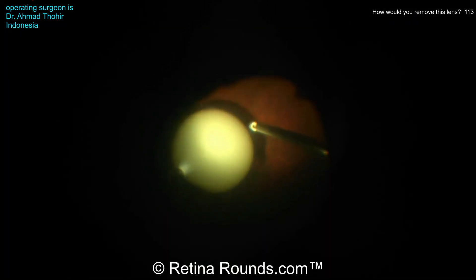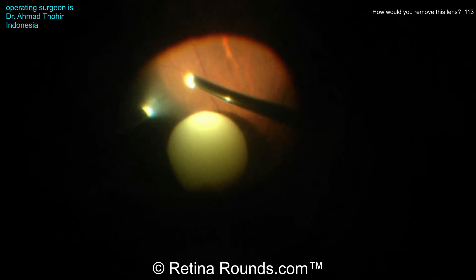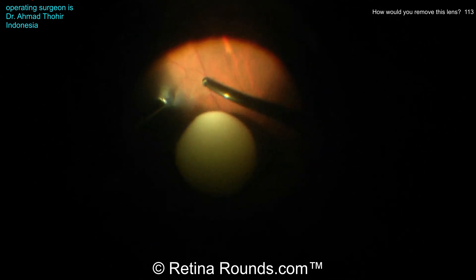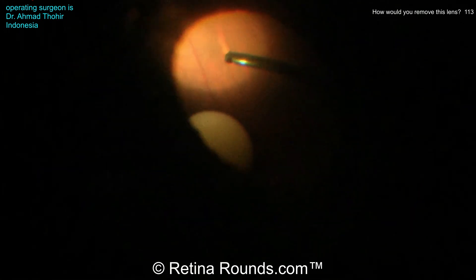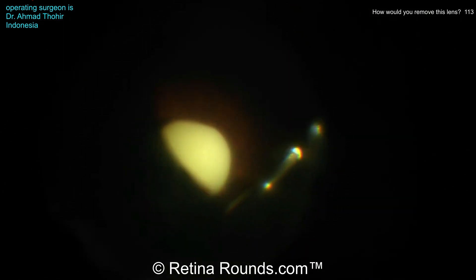Dr. Tohir is starting with a core vitrectomy. This patient has not been previously vitrectomized, and that's a really good idea because whatever method you want to use to remove this lens, you want to make sure that there's not any undue traction on the vitreous and the retina during the lens extraction process. Once Dr. Tohir has performed a complete vitrectomy, ideally with some peripheral shaving of the vitreous base, he can then tackle this dislocated lens.